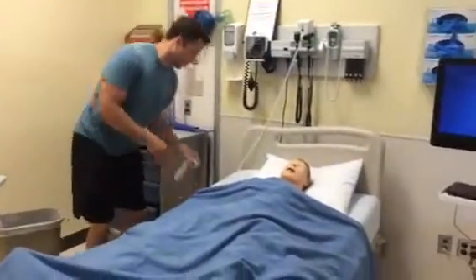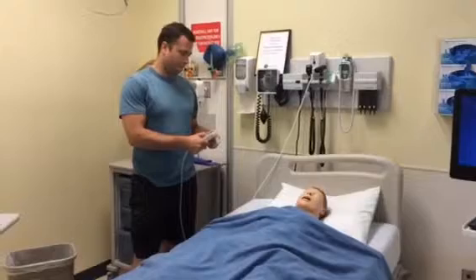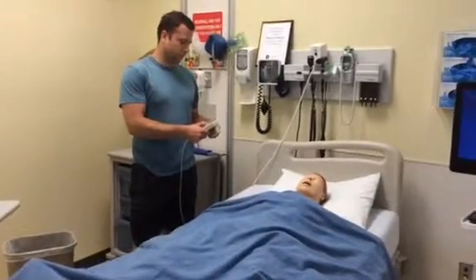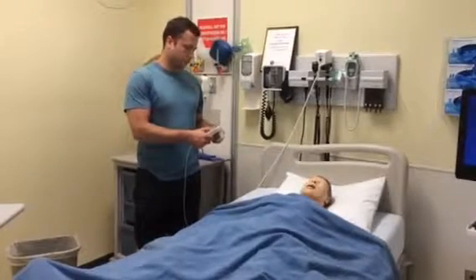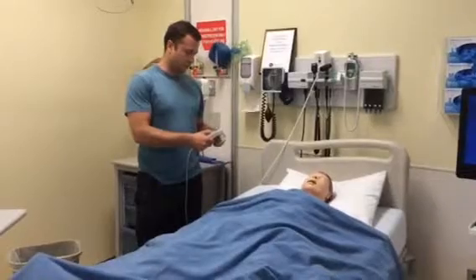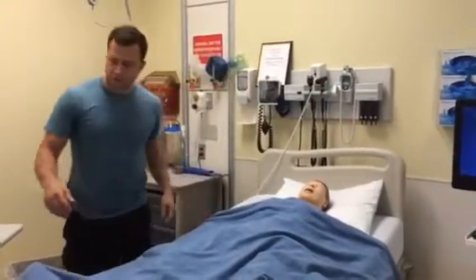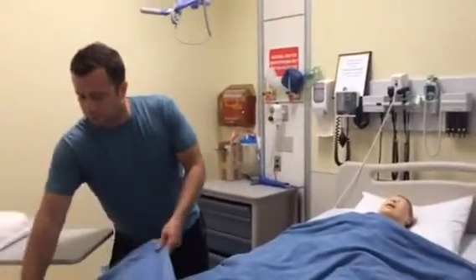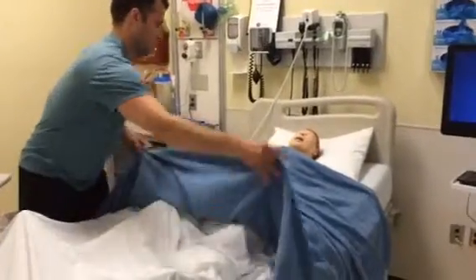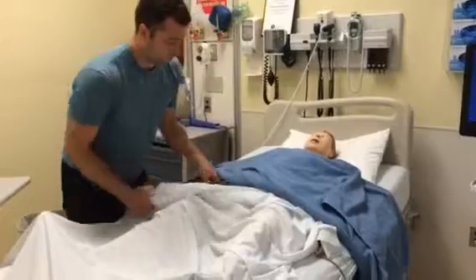Let me get that up so I don't break my back. Needs to go quite a ways here. All right. So I'm going to move the top blanket up and just leave it on your torso. And I'm going to pull this bottom blanket down, so I'm going to go ahead and expose you at this point.